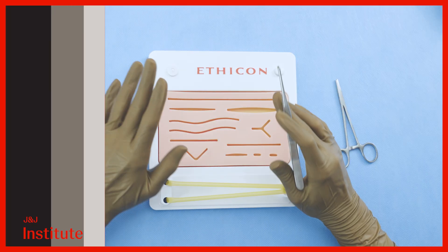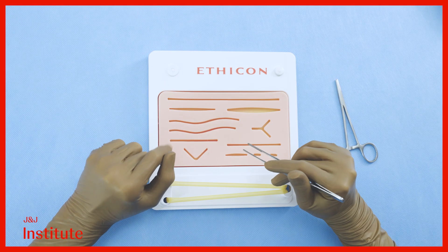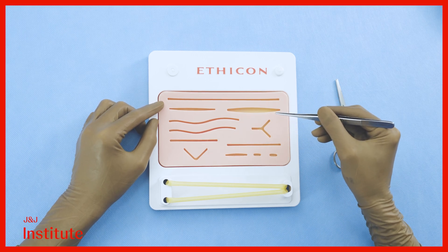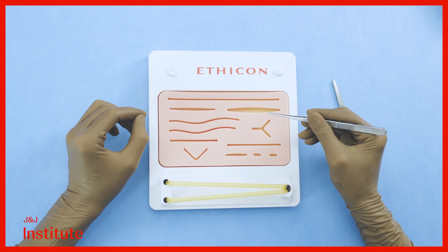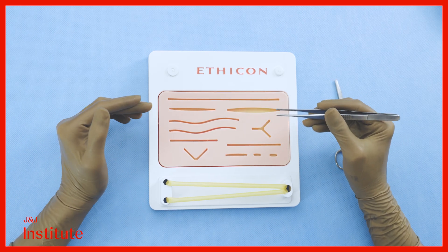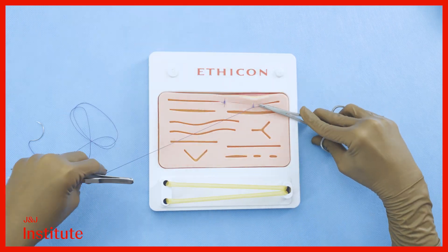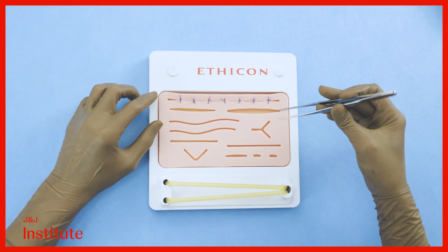Broadly, there will be two types of incision that you will need to close. One will be straight with very well opposed edges, while the other might be elliptical. For proper closure, the length of the ellipse should be at least three times the maximum width — a higher ratio is always better for cosmesis.